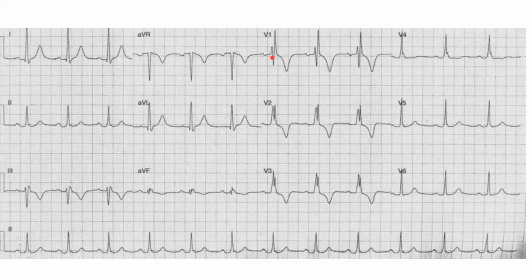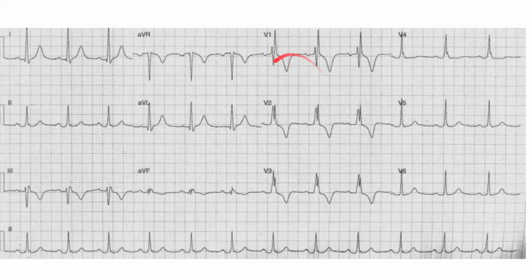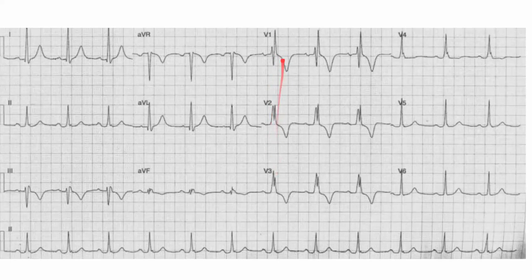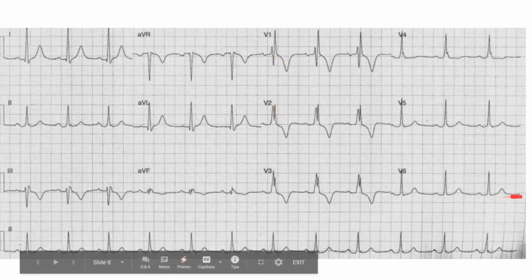There's an R and an R prime here, and that's going to be your rabbit ears of bundle branch block. The beginning of the R wave — there's an R, there's an S, there's an R prime right there. So you measure from the beginning of this R to the end of this R prime, and it's going to be bigger than 0.12 because it's upward in V1 or V2. It's on the right side, and so the deformity sort of names the side. This is right bundle branch block. We name it according to whether it's upward on this side or on its opposite side. Right bundle branch block.